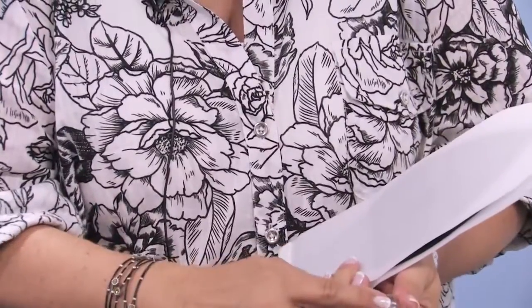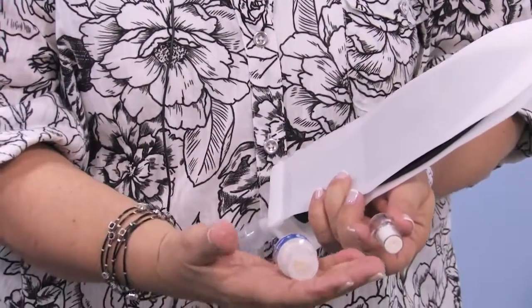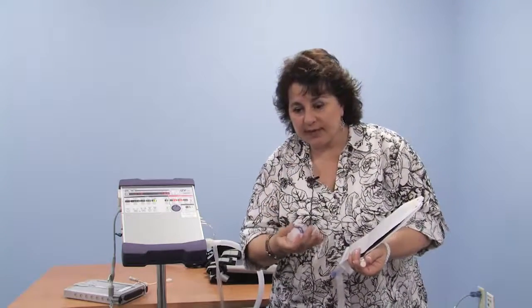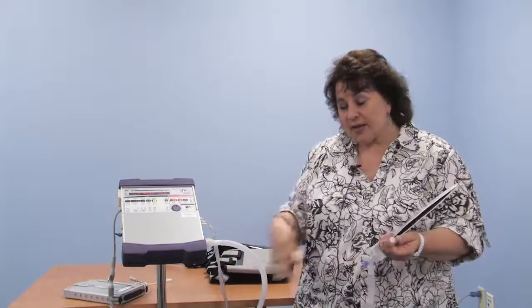They come in neonatal sizes, and this is an adult size. They also come much larger. So let's make sure that what gets delivered to your home is the appropriate size for your child's size of breath and humidification needs. While using the HME, which has the paper in it that captures heat and moisture from the air that you blow out and gives it back to the next breath you take in, it's trying to reduce the humidity deficit of not having a heated humidifier in the circuit.